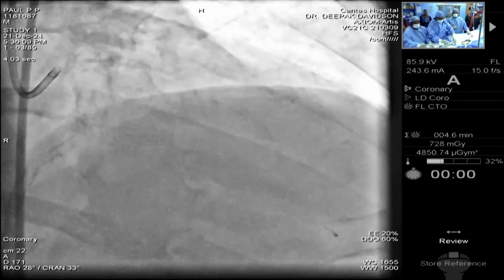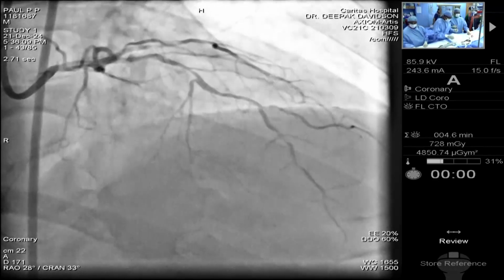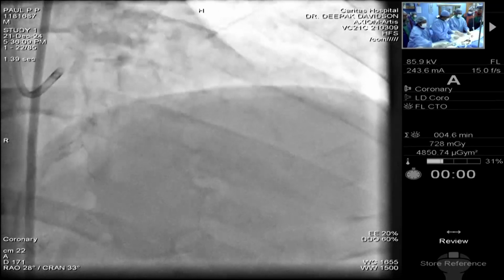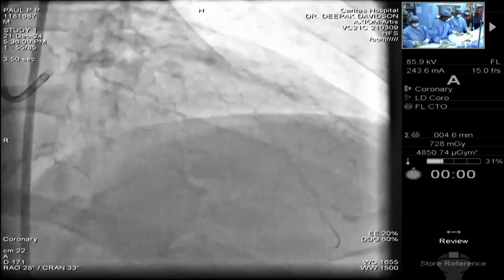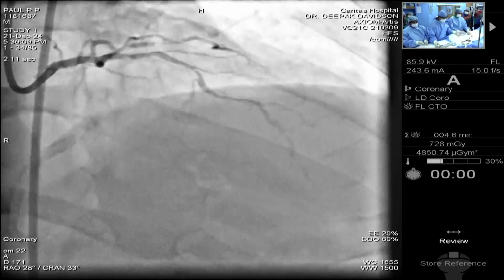We'll have the lock knob, lock, then we'll check the speed. Vishnu, hold it up. We'll check the speed at 80,000 RPM. Okay, that works. Now we'll go in.